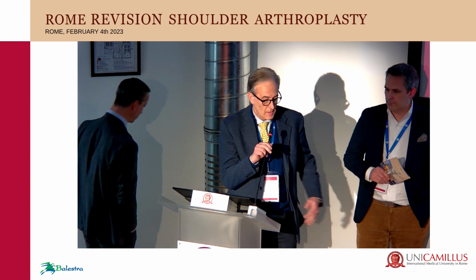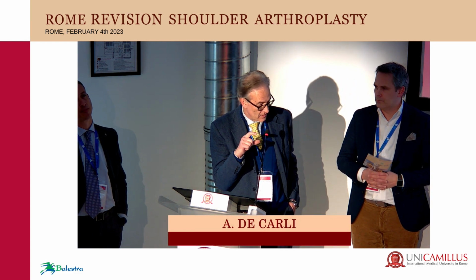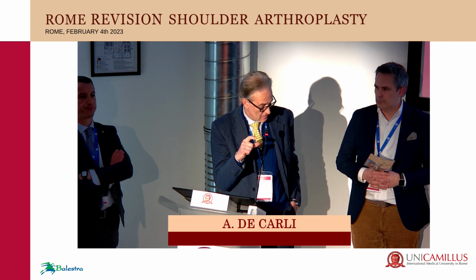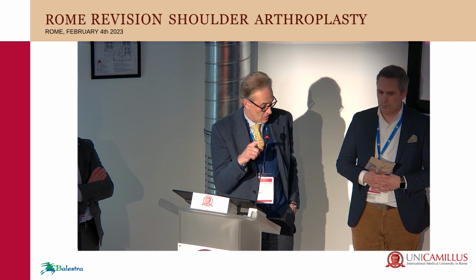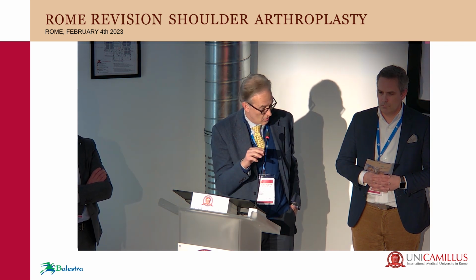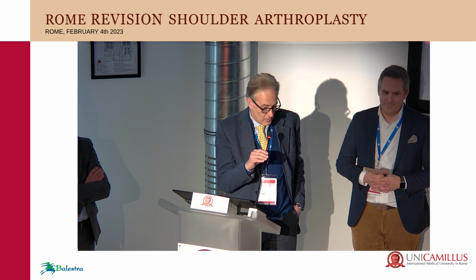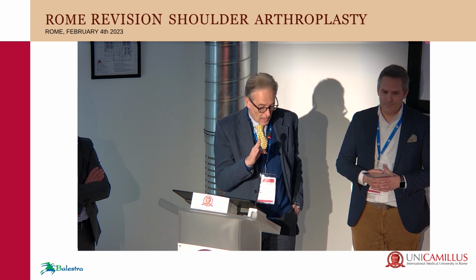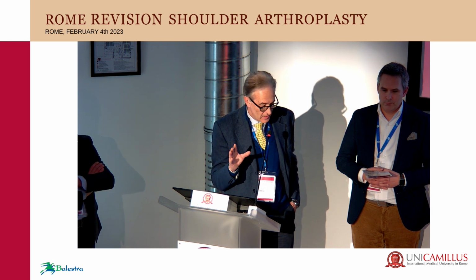For me, the pre-op planning is important, and trying to have the size of the defect that we are checking for, and testing the tension of the conjoined tendon, not the long head of the biceps, as you saw before. And after you have considered, you have to lateralize on the other side, but you can plan everything.